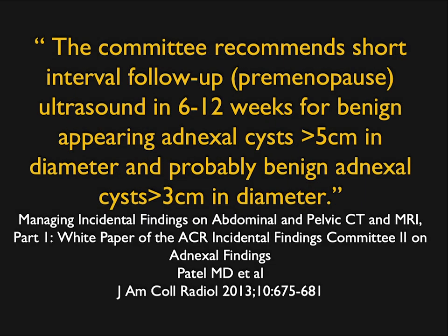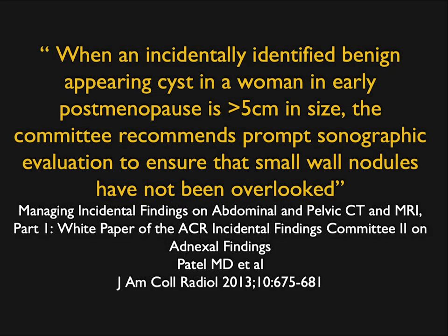And what do? The committee recommends short interval follow-up, ultrasound in 6 to 12 weeks, not right away, for benign appearing cysts over 5 cm in diameter and probably benign adnexal cysts over 3 cm. When an incidental benign appearing cyst in a woman in early menopause is over 5, the committee recommends ultrasound to ensure that small wall nodules are not being overlooked.